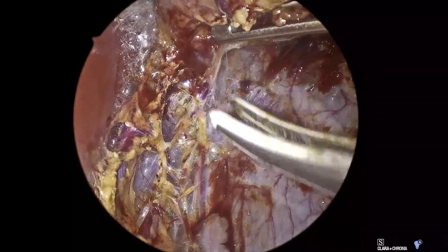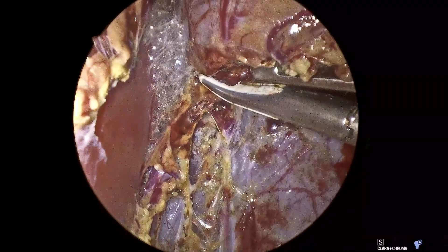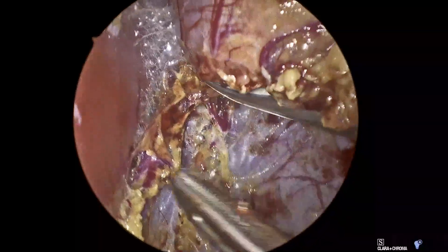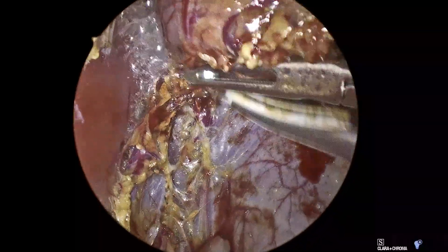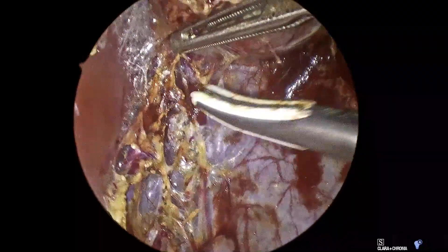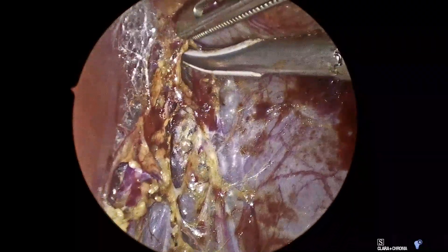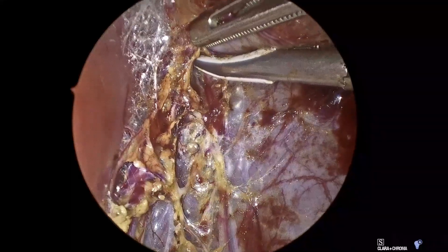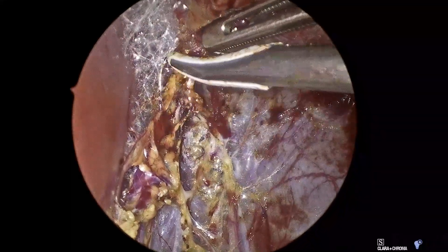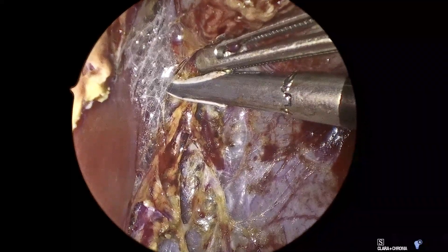In this particular case, the short right adrenal vein was tucked underneath the pheochromocytoma, and using meticulous dissection, I mobilized the tumor off the IVC.